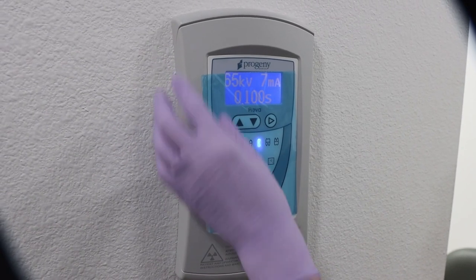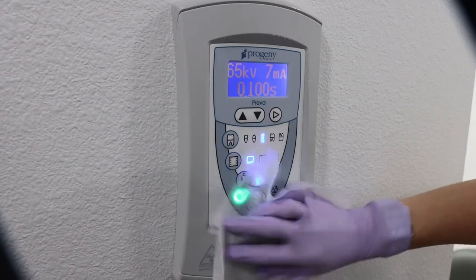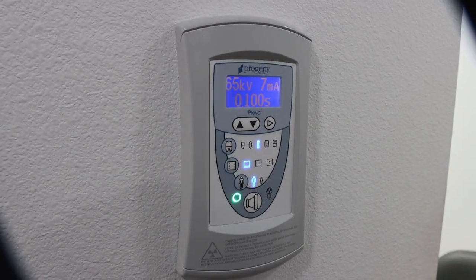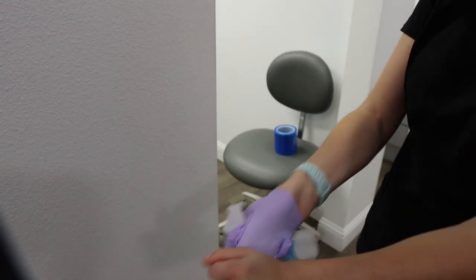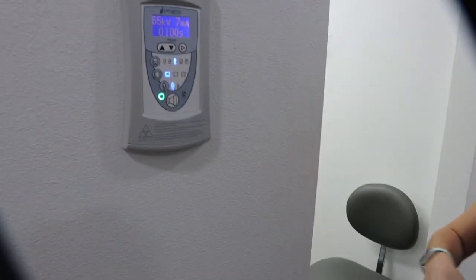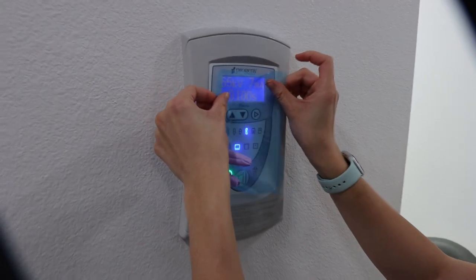To clean the x-ray button panel, you want to remove the barrier and wipe the entire panel. You're going to deglove and then place a new barrier over the panel.